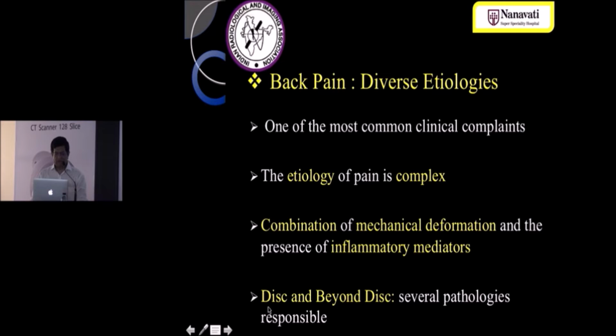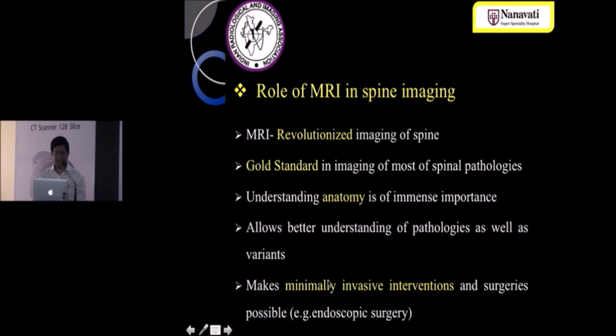There are several causes of backache. We're going to cover disc disorders and a lot of disorders beyond the disc which give rise to backache. The role of MR in backache is very, very revolutionary. Currently, it is the gold standard of imaging in most of the spinal pathologies, whether it is degenerative disc disorders, whether it is infection, whether it is tumors, or anything else.